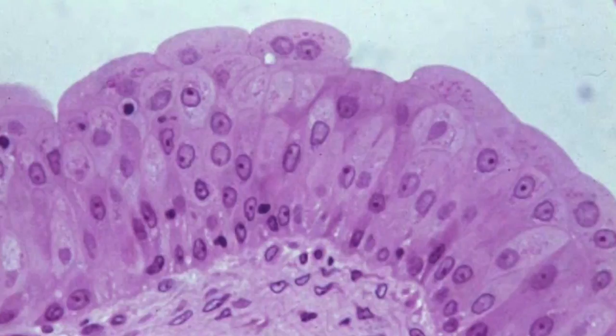So again, transitional epithelium, look at the top cells. They are round, not flat, and there are many layers. So, transitional epithelium.